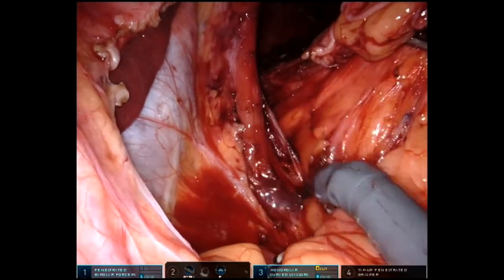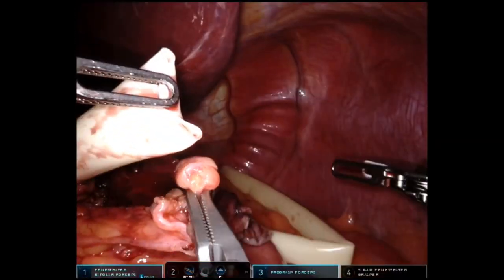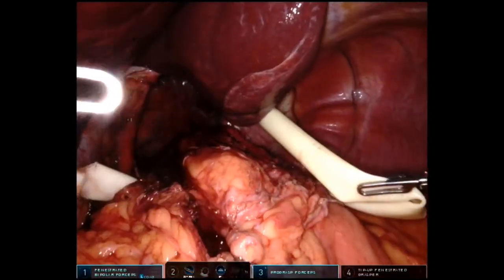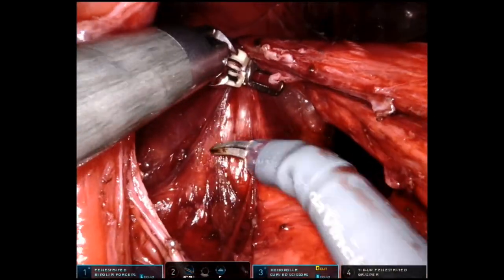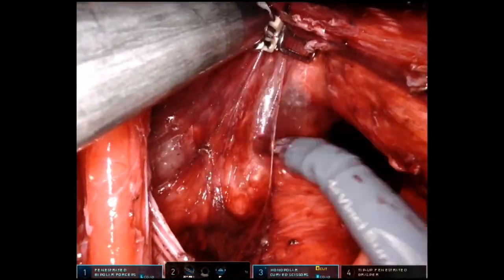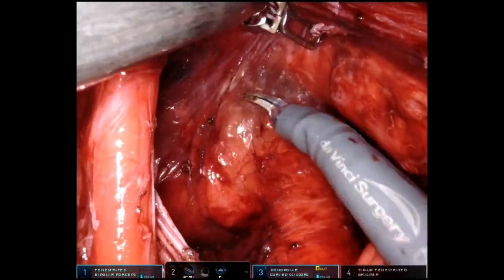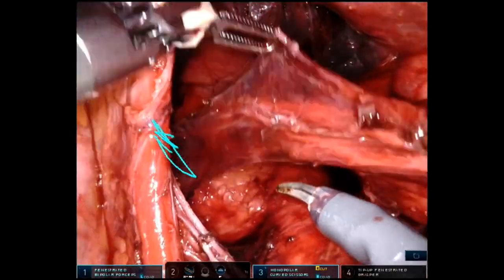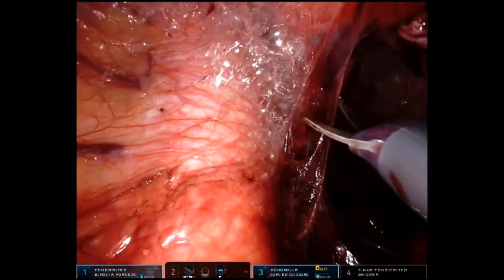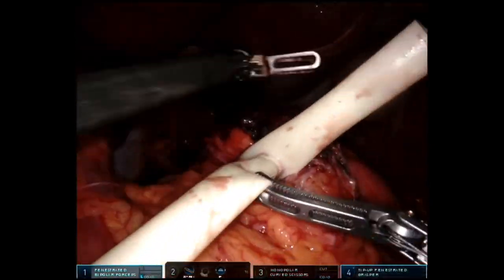Going back on the right side, you can see the inferior vena cava and the right crura muscle. We're taking a Penrose drain and putting it around the GE junction — the gastroesophageal junction — which helps retract the esophagus in an atraumatic way, lifting it away from the aorta below. We're taking that mobilization of the esophagus way high up into the mediastinum, and this is what keeps the tension low when we are done with the surgery. You can see the aorta nicely below that white tubular structure.